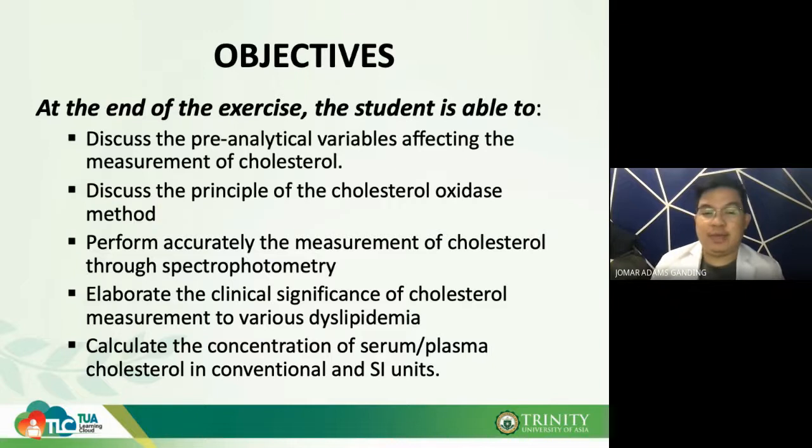that particular topic. Aside from that, our goal is also to discuss the principle of the cholesterol oxidase method, which is the enzymatic method used to measure quantitatively the levels, or the concentration, of cholesterol inside our body.